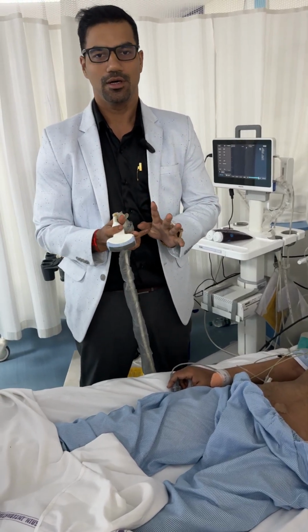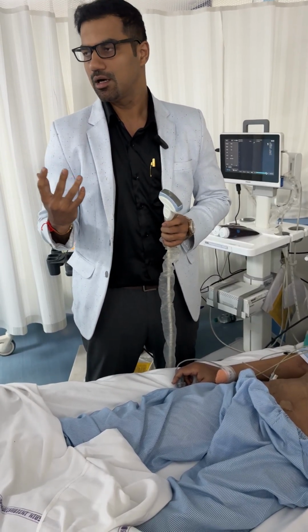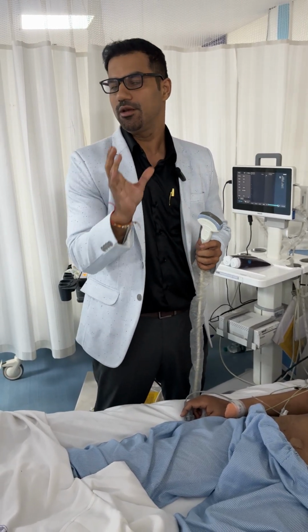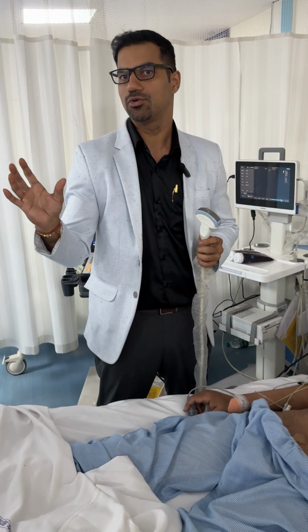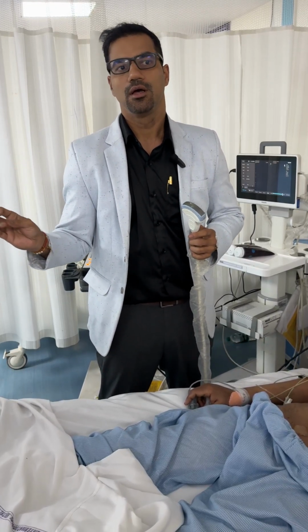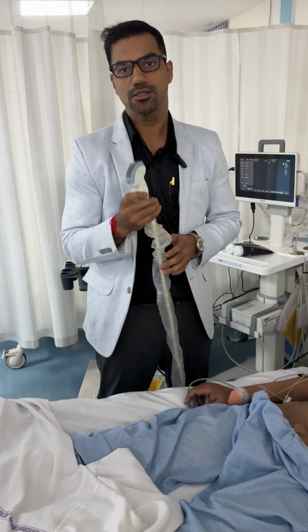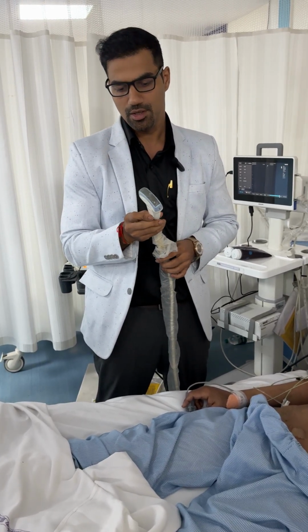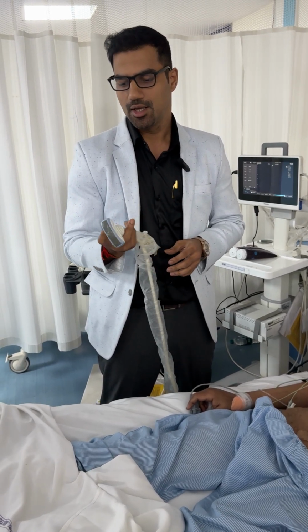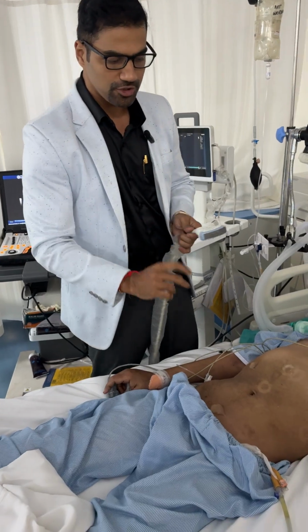Okay, so I believe that everybody must have heard the concept of FAST. What is FAST? FAST is basically focused assessment sonography for trauma. Now, what we do in FAST is that we take this curvilinear abdominal probe of almost 1 to 5 megahertz, and we place it in four positions.